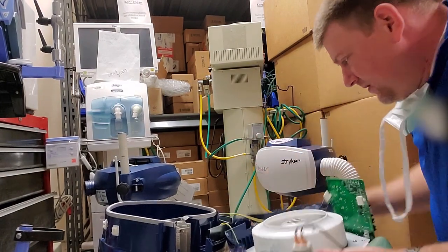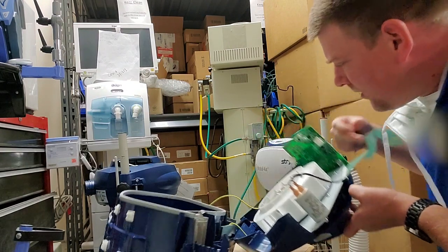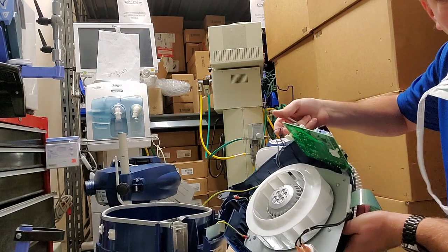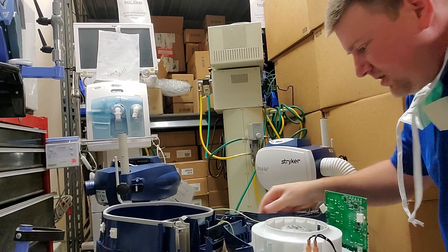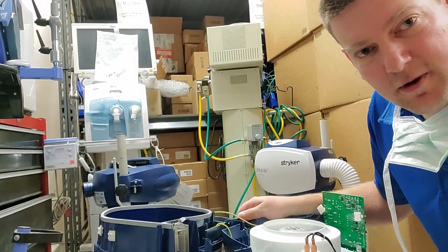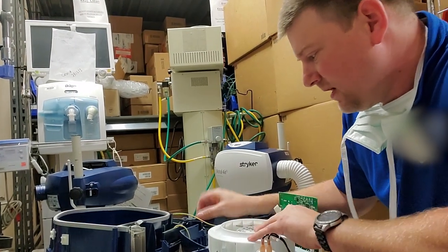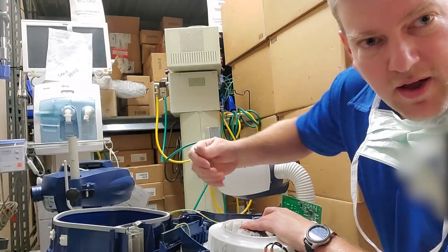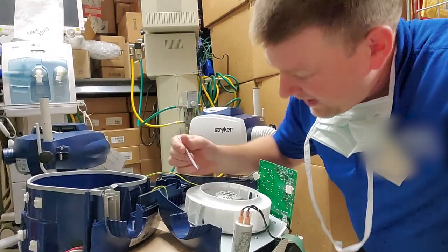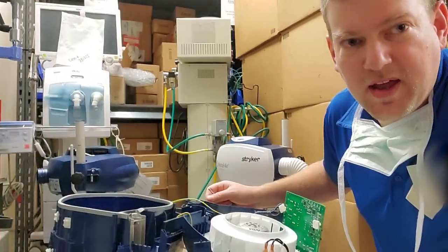The fan looks like a typical AC fan. The fan power comes from these two cables — just a regular AC fan. The frequency of line voltage is what determines the speed of the fan, so it's a constant velocity fan. It's got a couple of weights on the blades — you can see this little black speck, that's a weight so that it's balanced out.